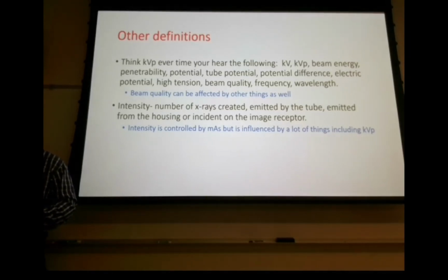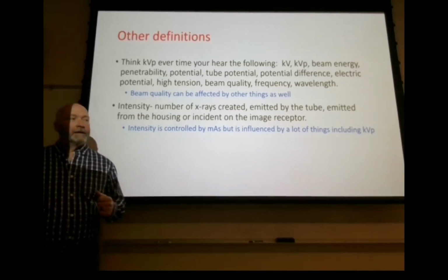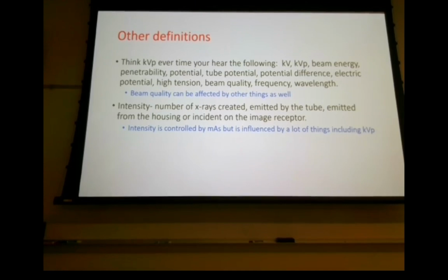You've got downtime at clinicals, I know you do. I was a student once, I was a clinical instructor once. There are times you're standing around and you're not doing anything but gossiping, right? How much good is that doing you? Really? Get your butt in the room and start shooting stuff. Learn something, right? So try it. Just try it. It's fun, really. Once you get into it, because you start making exposures, you're like, wow, that didn't turn out anything like I expected it to. Let's try this, and we'll do something different, right? So play with the machines.